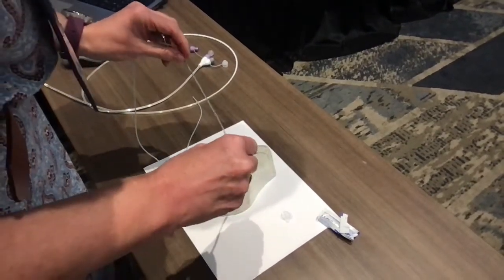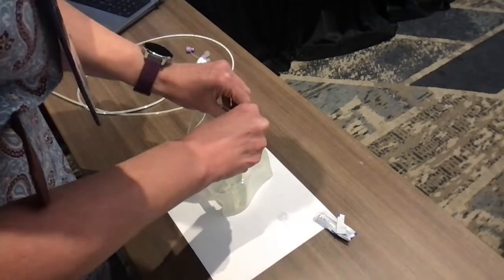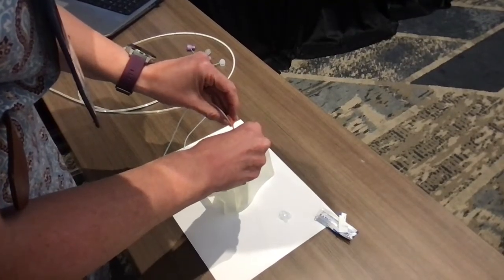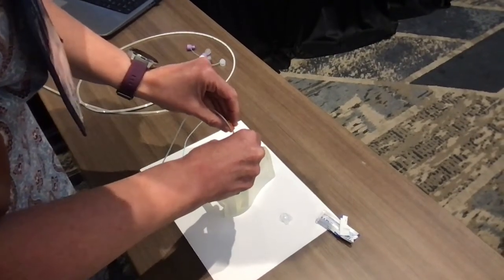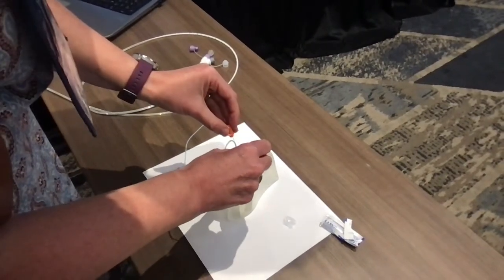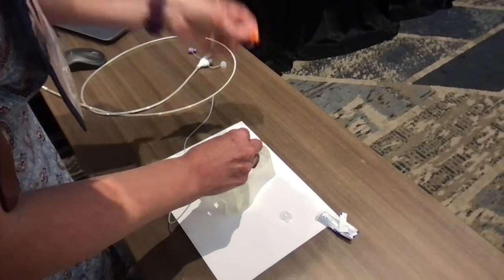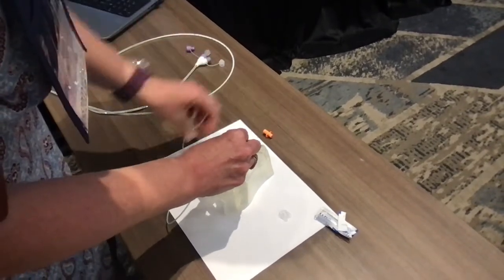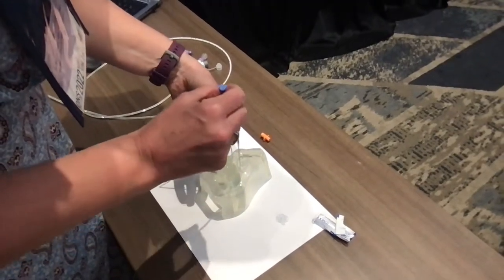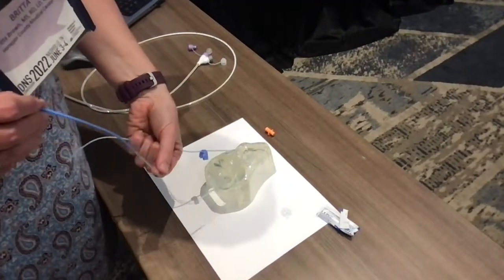Go straight back and you can do one stylet at a time — go in with one and then the second, and when you get there you'll hear the magnets click. If you aren't sure, you can pull back a little bit and you'll feel tension on those filaments. Once you've heard the magnet click, you can remove the wire, set that down, and the side with a handle you can gently pull and bring out, then disengage the magnet.